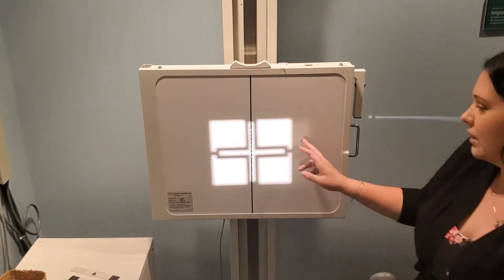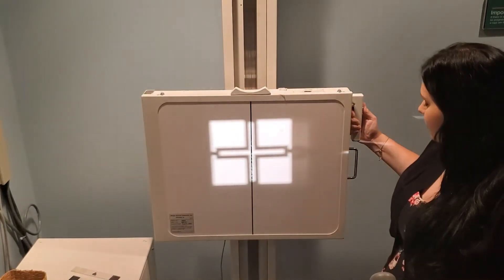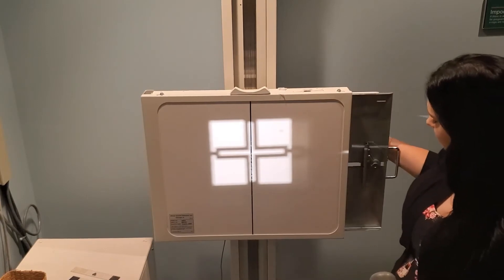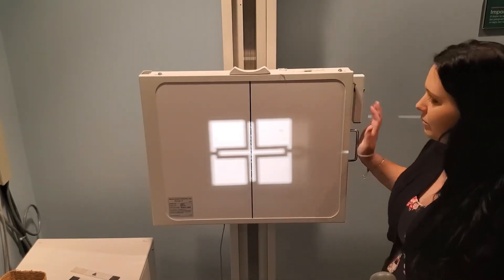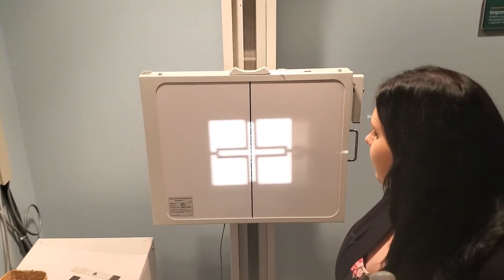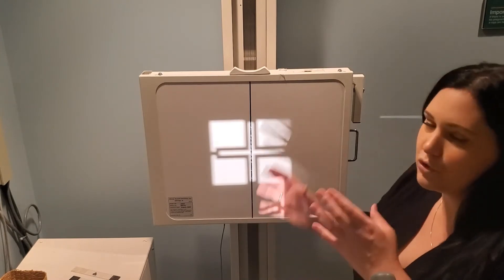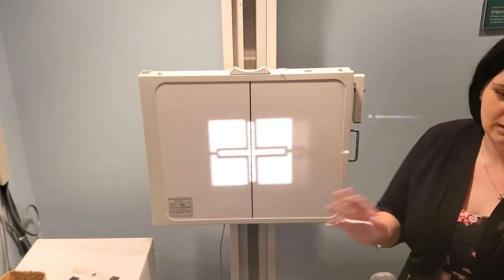This image uses a 10 by 12 lengthwise cassette. Make sure your CR and your bucky are aligned. We will likely need to go higher when the patient comes in, but always start with everything aligned and ready to go so you don't have to worry about it later. Touch the tube, touch the bucky — I've said it a thousand times and I'll say it a thousand more.